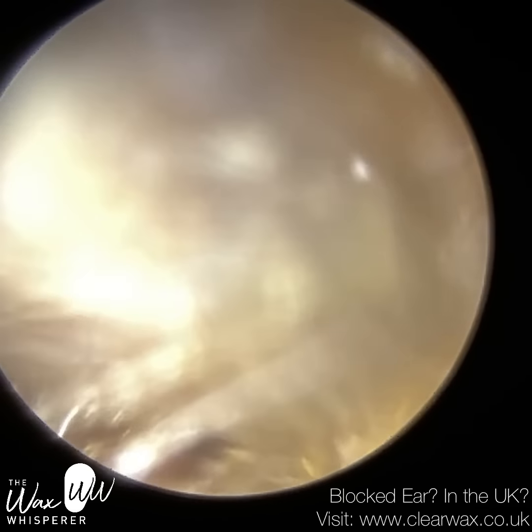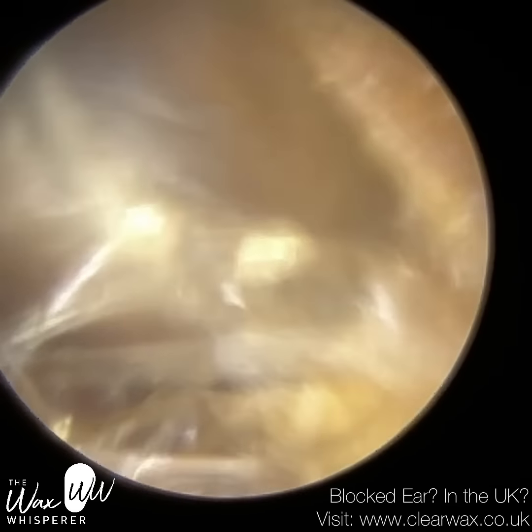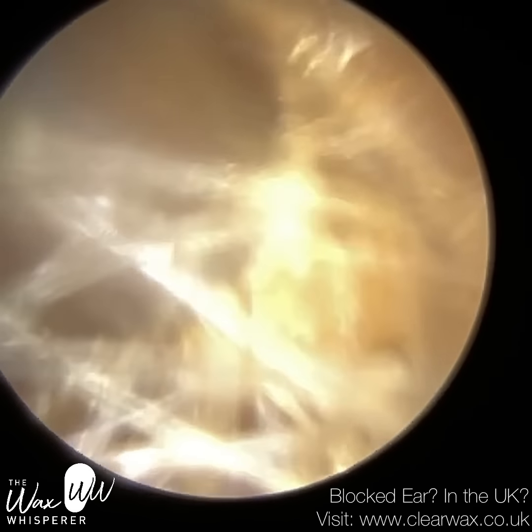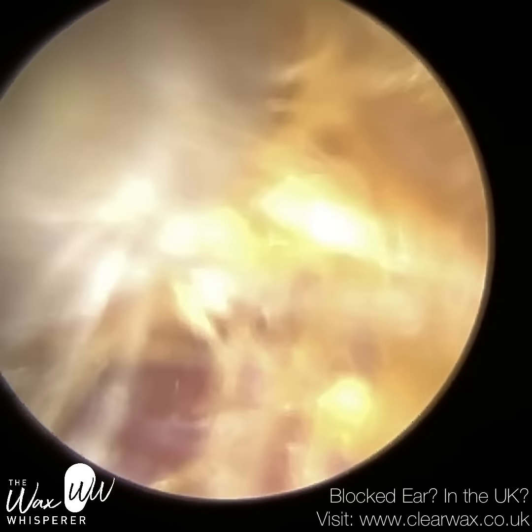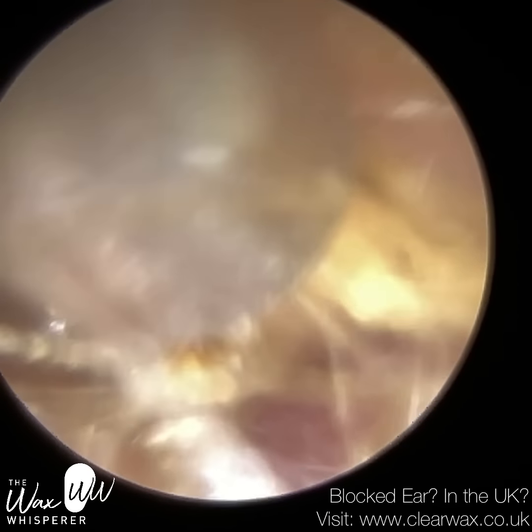I'm just using the endoscope to stretch the patient's ear open. This patient has to attend every nine months to have their earwax removed, and no doubt it's their ear anatomy that's contributing to this buildup of wax and dead skin in the ear.